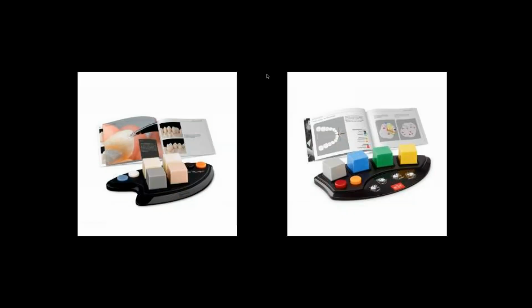So basically, when I start doing the wax up or diagnostic wax up, I have these two kits from Renfert, and the first one is the aesthetic wax, with which you can mimic the exact color of the tooth.